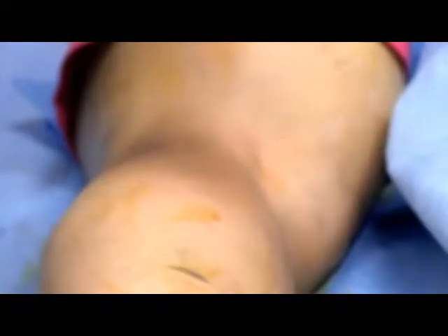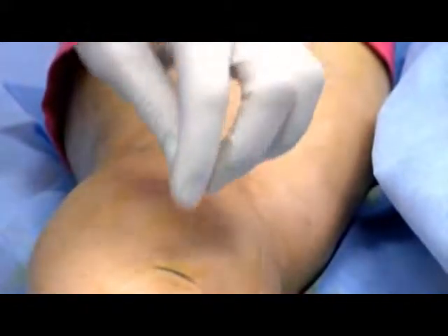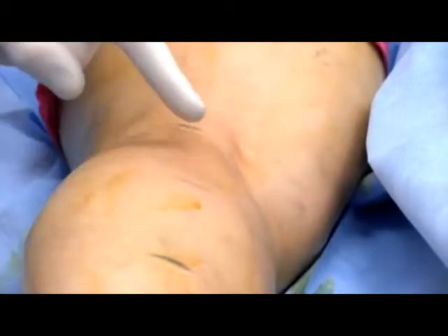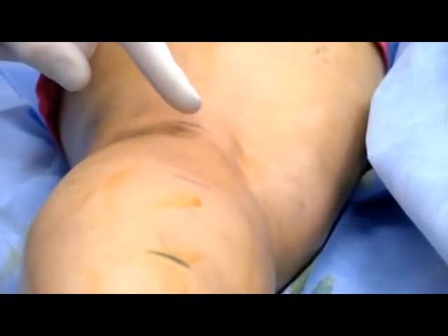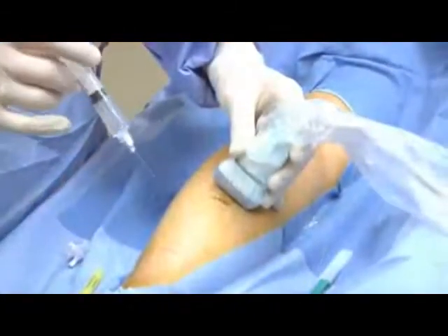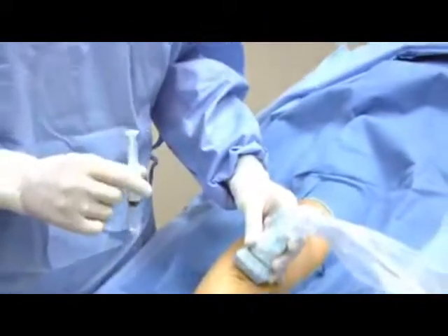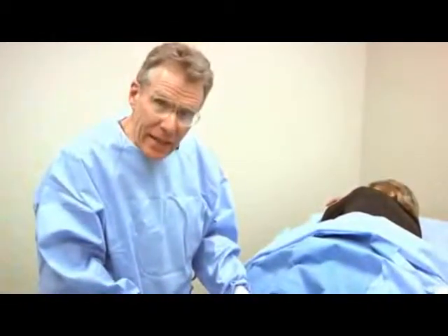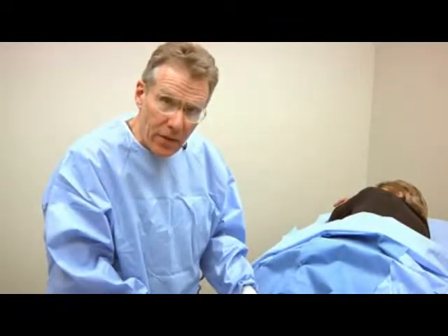Our plan is to drape the patient, to insert a small catheter in the back of the leg, and through that catheter advance what we call a radiofrequency ablation catheter up to the appropriate point, and then gradually warm the vein and shrink it as we do so. The first step is to introduce a small tube or catheter in the leg, and to do so we put some local lidocaine or novocaine anesthesia as a small wheal in the back of the leg in the skin.